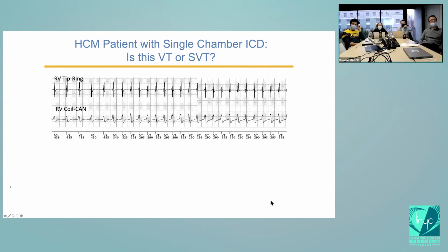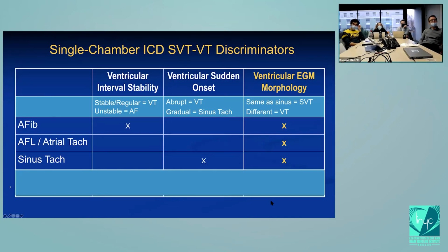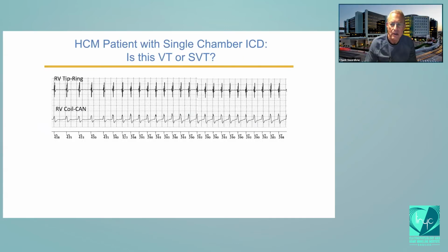All right. Is this VT or SVT? How would you know? Well, you can say, Chuck, in a single chamber device you can't tell for sure.